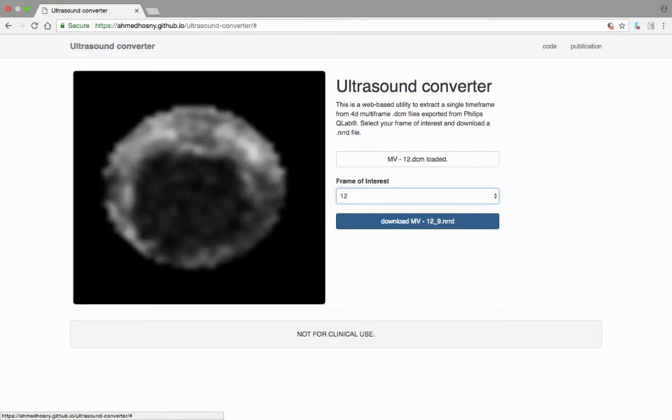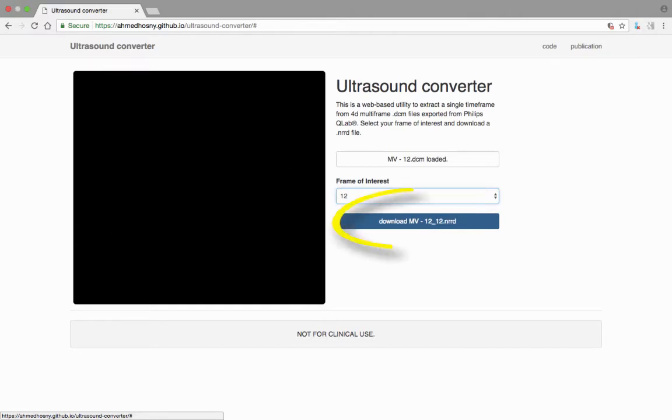Once selected, the website will automatically process the dataset. A third and final link now appears on the site, giving you the option to download the NRRD file.